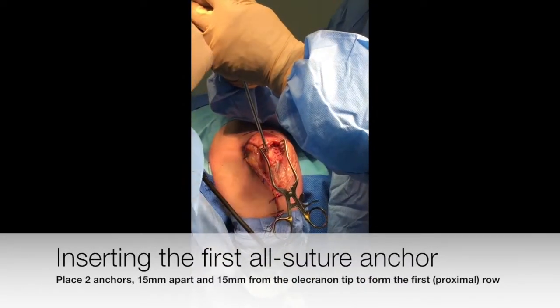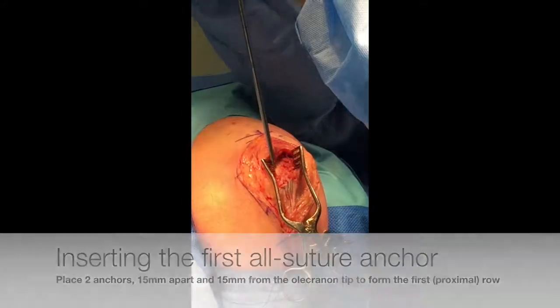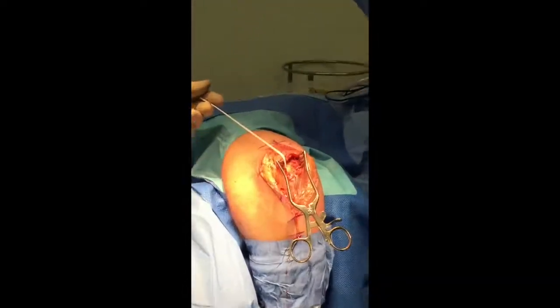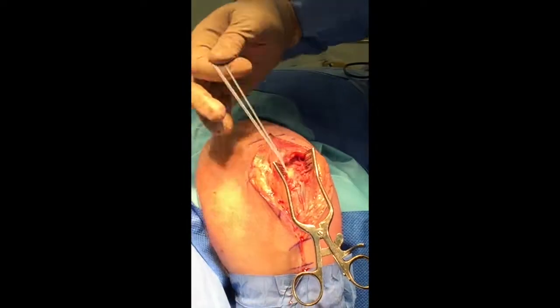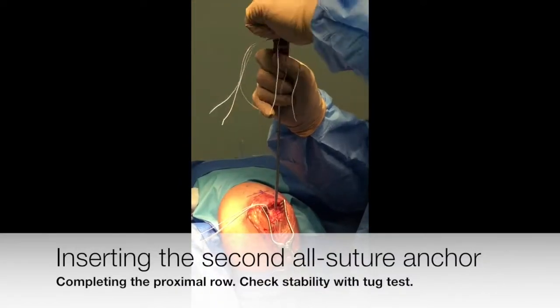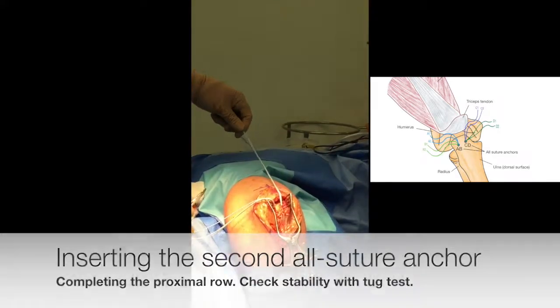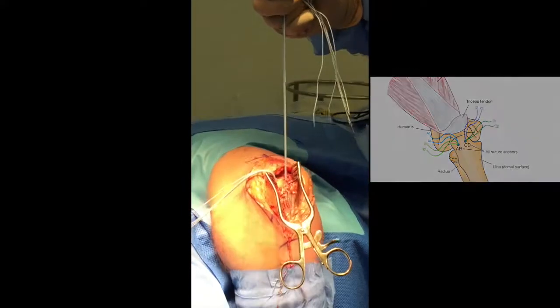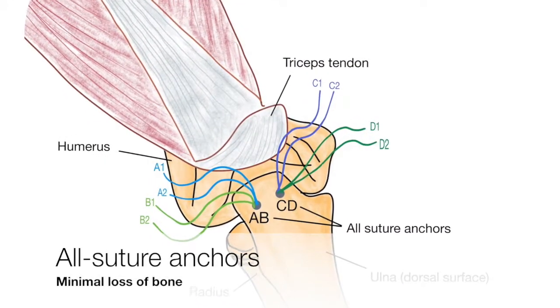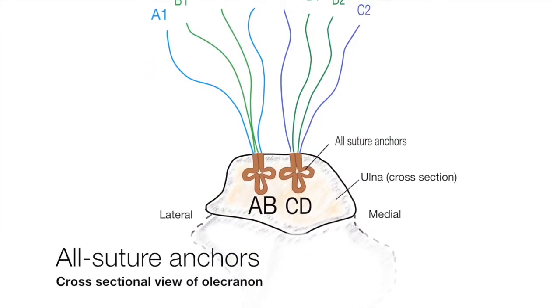The first, or proximal, row of suture anchors is placed approximately 15mm from the olecranon tip — first on the radial side and then on the ulnar side, 15mm apart. All suture anchors with 4–6 strands each are used to minimise bone loss and ensure a strong hold.